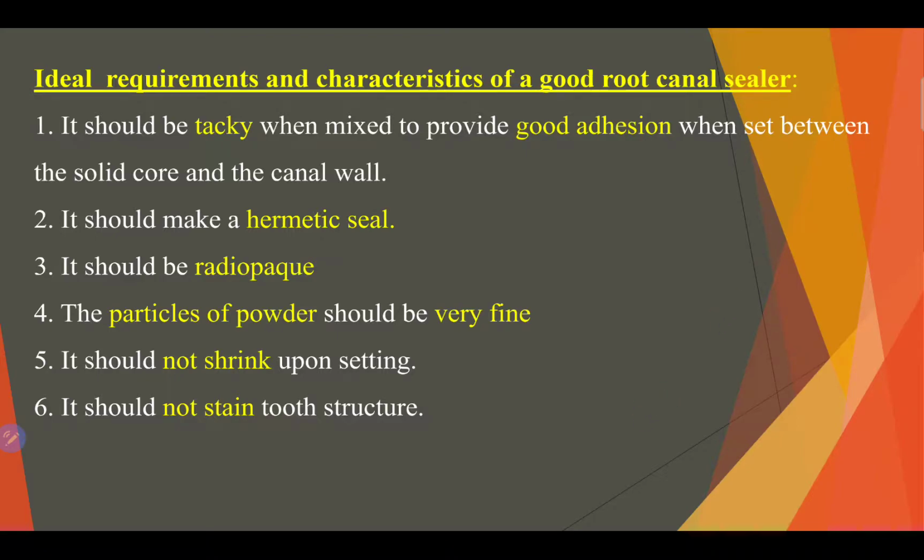In the powder and liquid type, how do we know the very good sealer from the bad one? Because nowadays there are many companies producing various kinds of sealers. When you see the powder of the sealer, the particle size must be very fine.